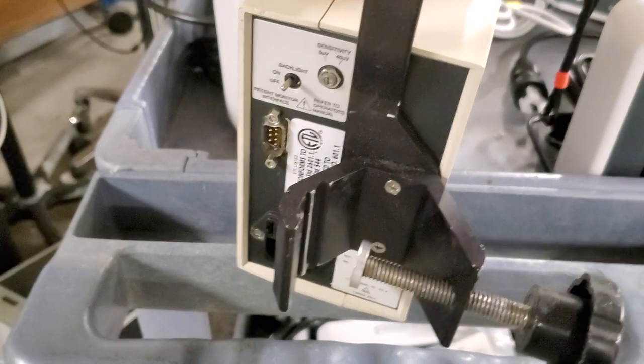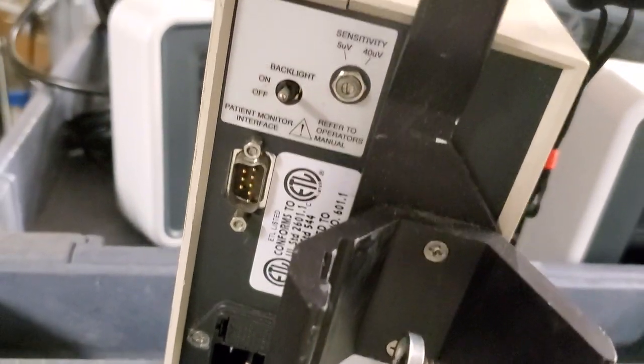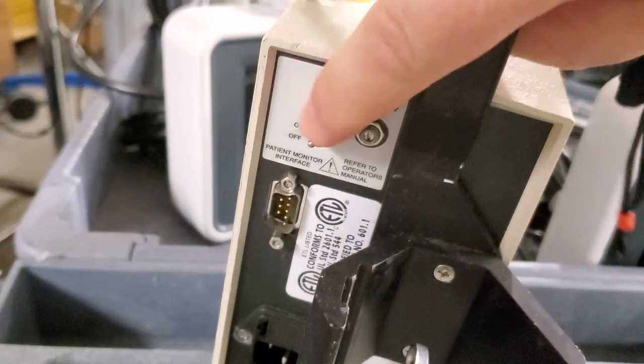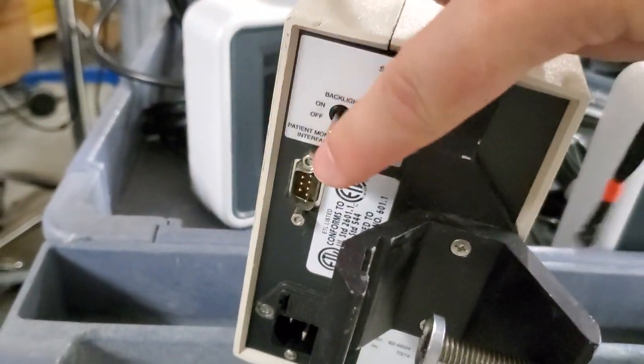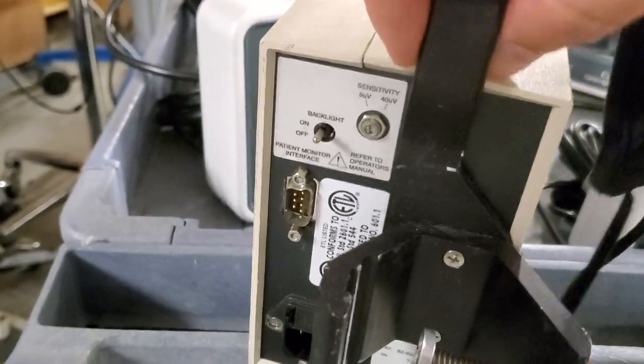You can see the pole clamp is an afterthought. It was added on the rear. It's got a serial data out port, very old school. You can see it's got a backlight switch. It's a physical switch on the back. Never had one of those break. Awesome.